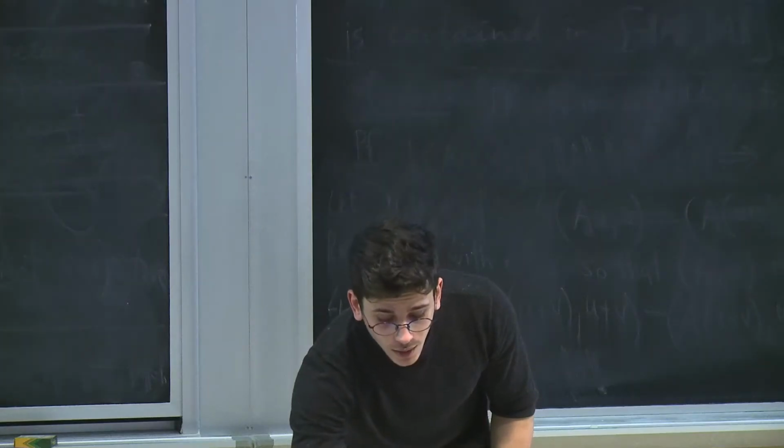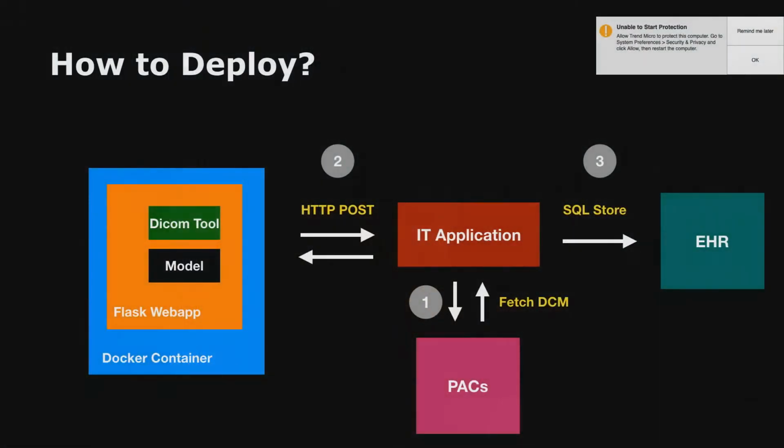And finally, so, we talk a lot about clinical deployments. We've actually done this a couple of times, and we're going to switch over to Connie real soon. In general, what you want to do is make it as easy as plausible and possible for the in-house IT team to use your tool. We've gone through this now, I don't know, it depends how you count, once for density and then three times at the same time. And I spent many hours sitting there.